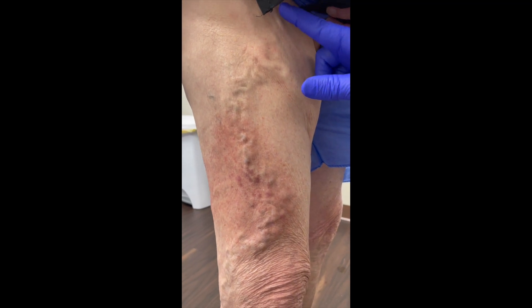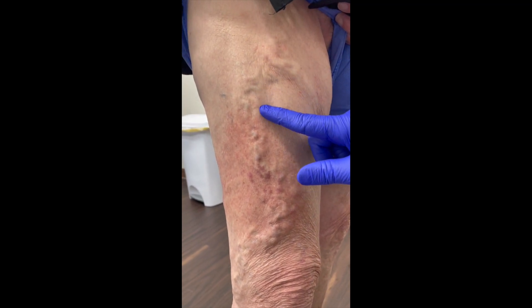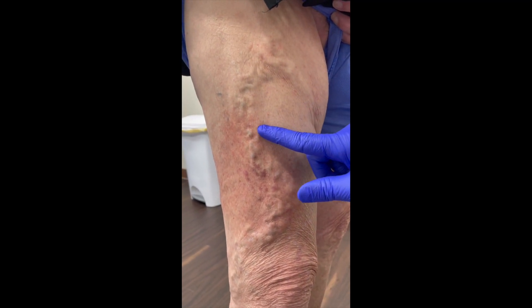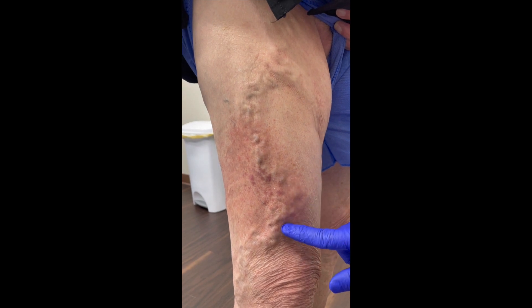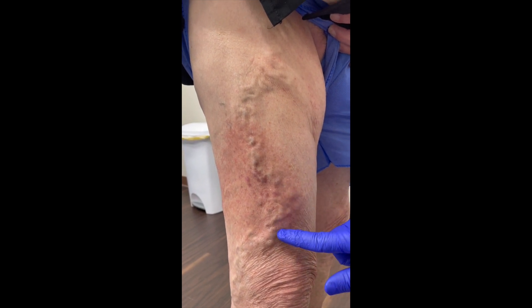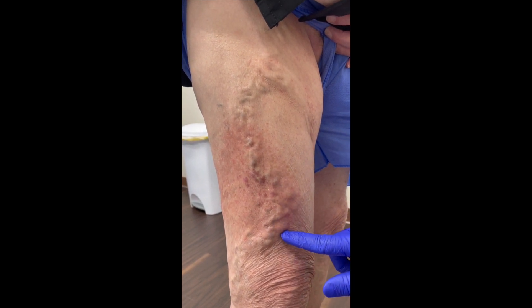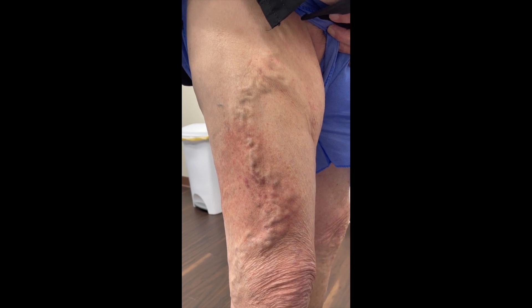Now this — you can see all these varicosities. This is from the anterior accessory branch, which I'll show you in a minute. It's a large dilated AAGSV right at the takeoff.